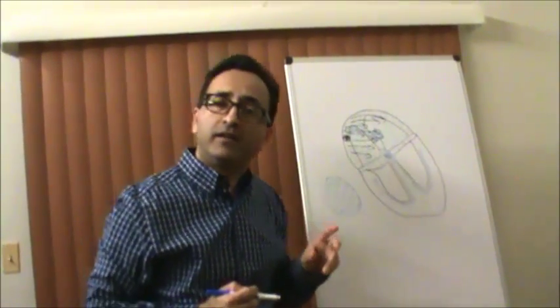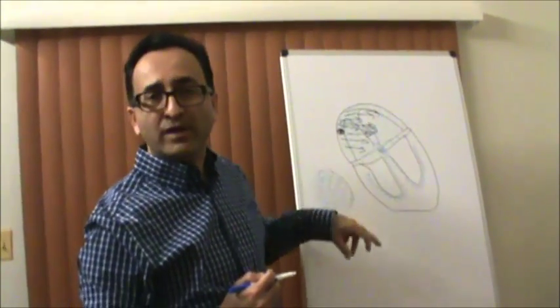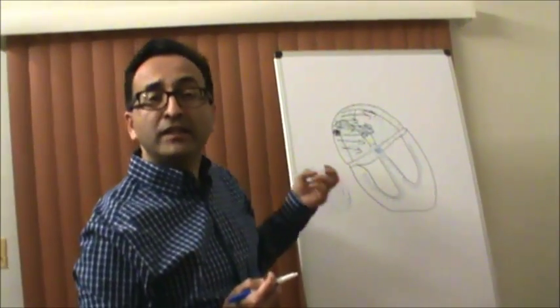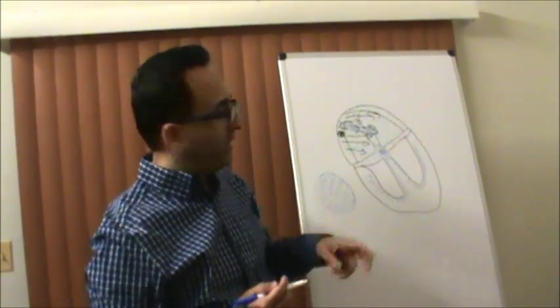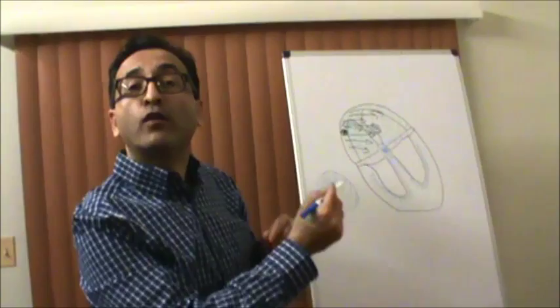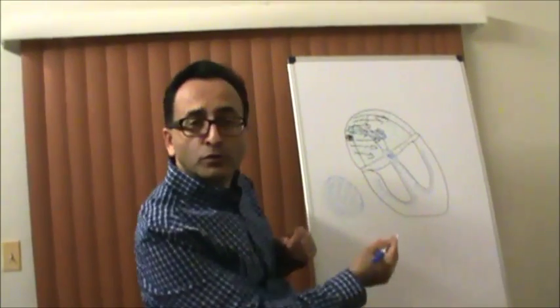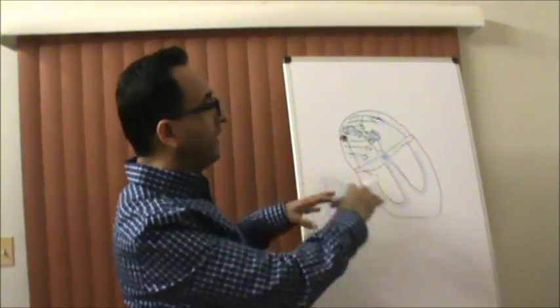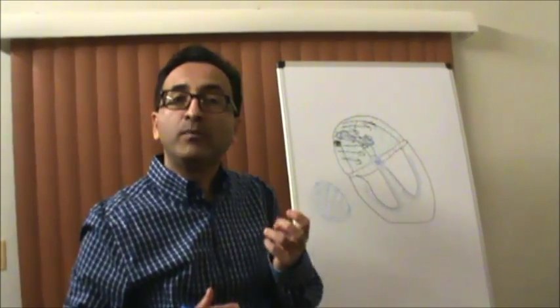Then the second electrical event occurs, that is the stimulation of the AV node. AV node is too small. The way cells are within the AV node, AV node just whispers. We don't see any activity on the ECG tracing. So that is the second event. Then what? From AV node through the bundle of His, it quickly passes through the left and right bundle branch and through the Purkinje system and fibers. It rapidly takes the process of what we call ventricular depolarization.